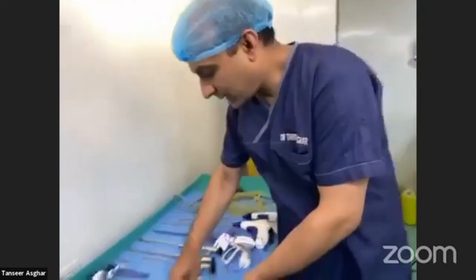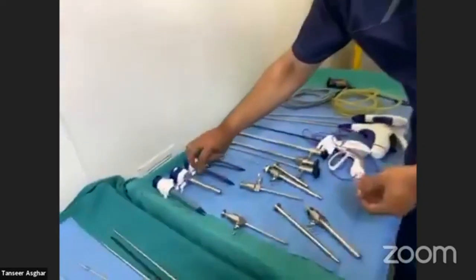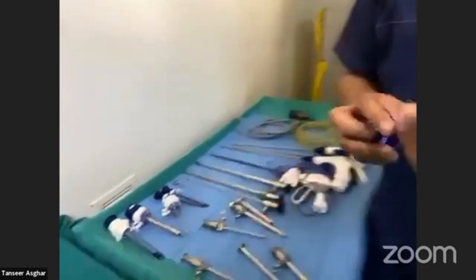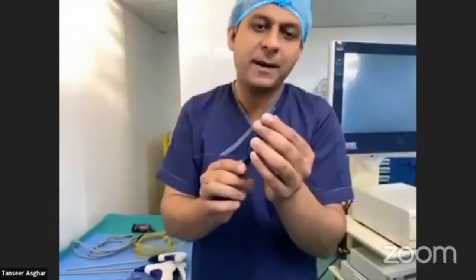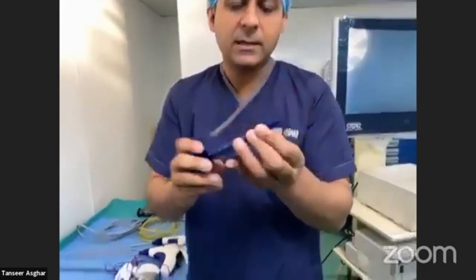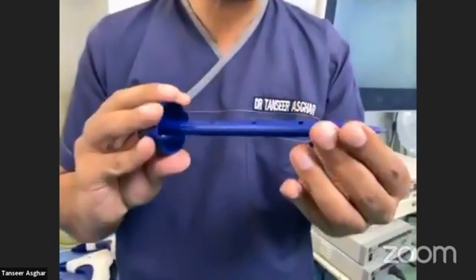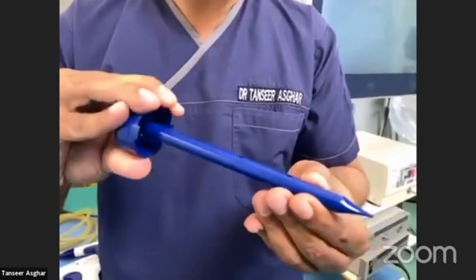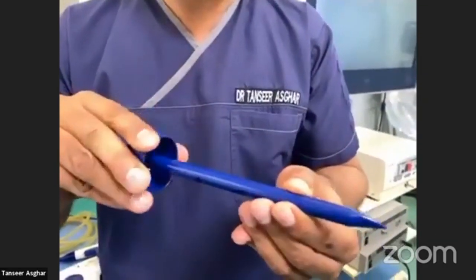There are other types of trocar as well, like this one. This has an end called a pyramid end — it looks like a pyramid. The superiority of this trocar is that when cutting into the abdominal wall, it gives more space and splits the muscles well.